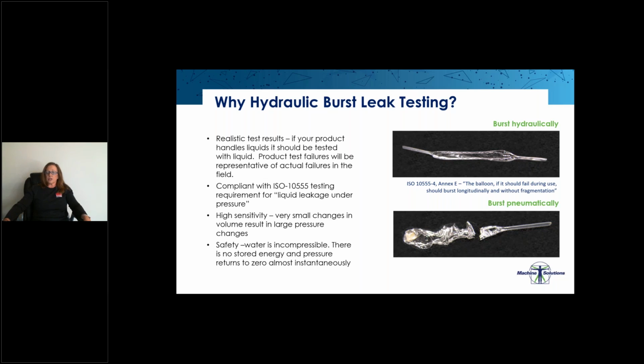I've included some images here of two raw balloons, two balloons that are exactly the same but tested differently. The top balloon was tested hydraulically with our HBLT. The balloon below was tested pneumatically with an indeflator. I think the photos speak for themselves. However, both products had a similar failure, a similar burst pressure, but you can see that the failure mode is very different.